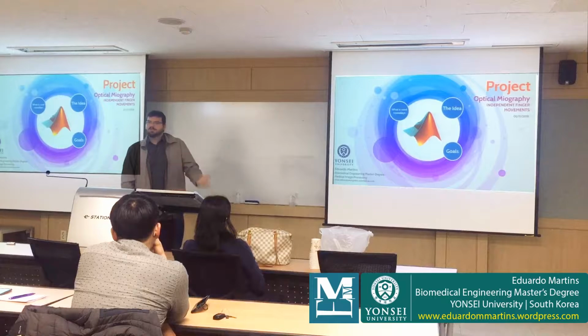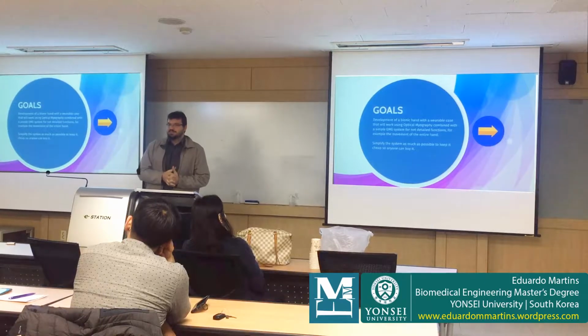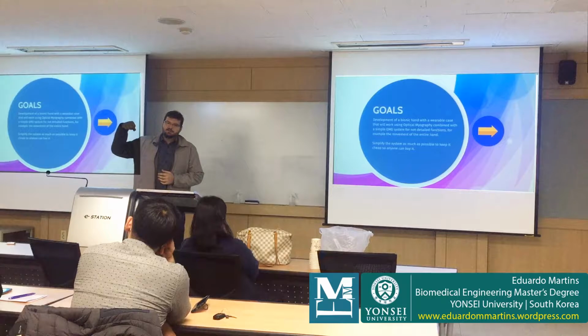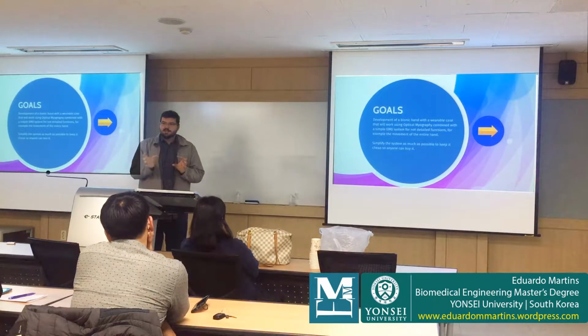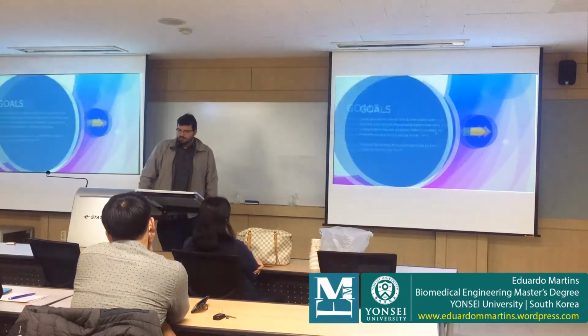And what are the other goals for this project? The development of a bionic hand with a wearable case that will work using optical myography combined with a simple EMG system. This system is used only to identify finger movements, and the EMG would be used for the whole hand, for example, to move the entire hand. I could do this with optical myography, but I didn't test it, so it can mix EMG and optical myography. For detailed functions, use the optical myography. The other goal is to simplify the system as much as possible to keep it cheap, so anyone can buy it. So this is my main project.